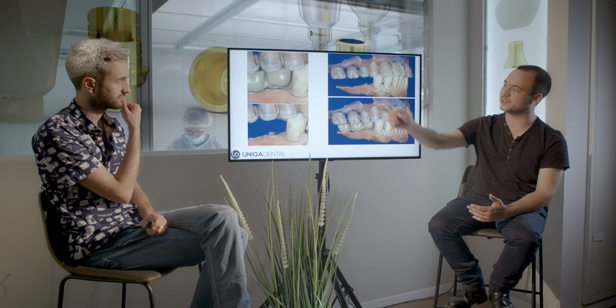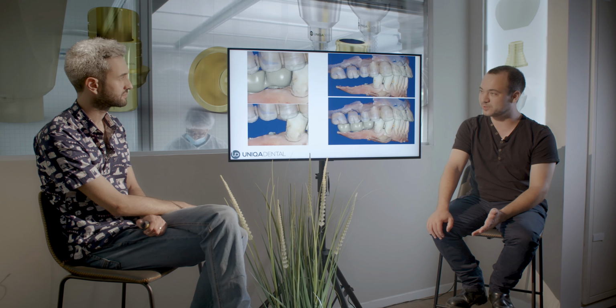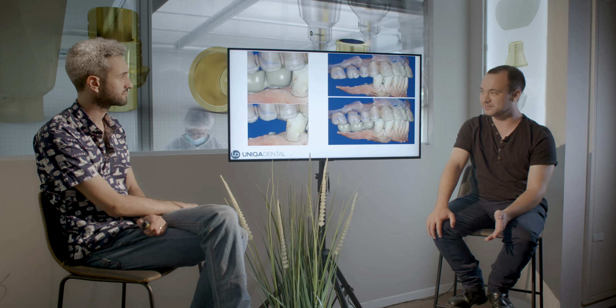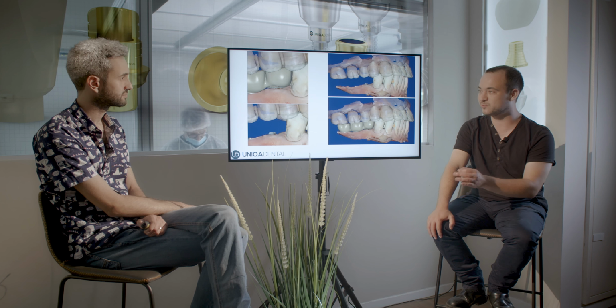With the CAD CAM, because I have everything digitally, I have the coordinates of all of the multi-units in the program. So if, for example, I look at this multi-unit, you can see the crown is a little bit higher. You can see this place. Aesthetically, I would want to change the multi-unit to 1 millimeter smaller. To do that with CAD CAM technologies, I just click a button in the program, and I have a different multi-unit.